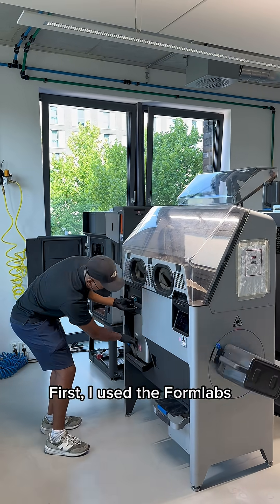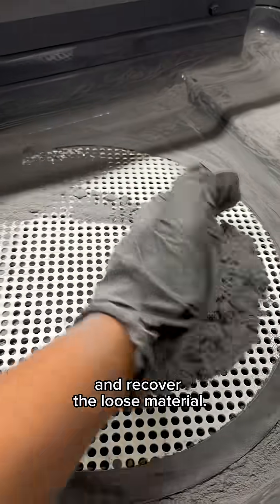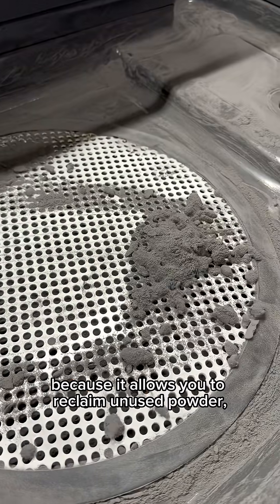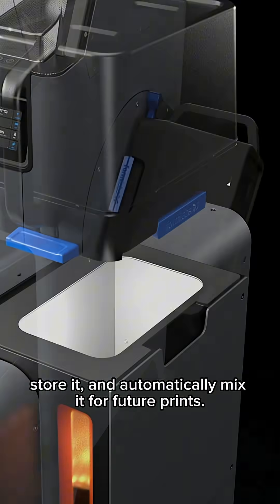After printing and cooling, I moved on to post-processing. First, I used the Formlabs Fuse Sift to break apart the powder cake and recover the loose material. This system is a game-changer because it allows you to reclaim unused powder, store it, and automatically mix it for future prints.